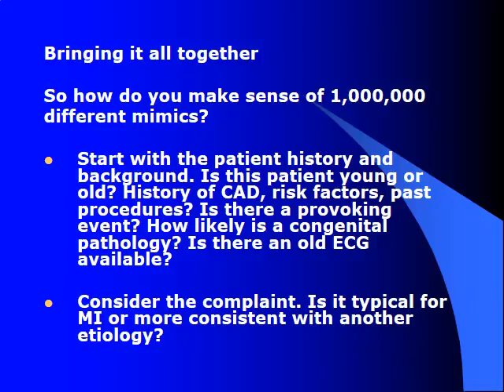All right, so the question is, how do you really make sense of all these different STEMI mimics? We need to approach all of our patients in a standardized manner, beginning with the patient's history and background. Is the patient young or old? Do they have a history of coronary artery disease? Any risk factors? Past procedures? Is there a provoking event? How likely is a congenital pathology, and is there an old ECG available?